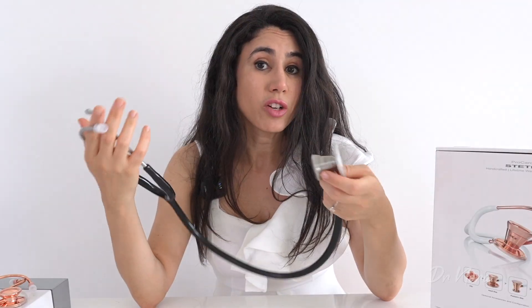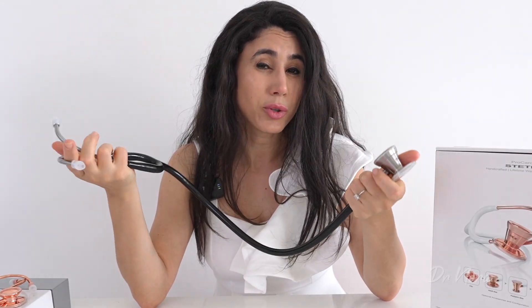So right here I've got the MDF Procardial Cardiology Stainless Steel Stethoscope. This is aimed at those who are more interested in cardiology and want to listen to heart sounds, but it could also be useful for medical students or even general practitioners who need to listen to heart sounds on a regular basis.